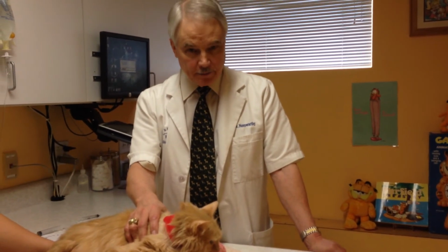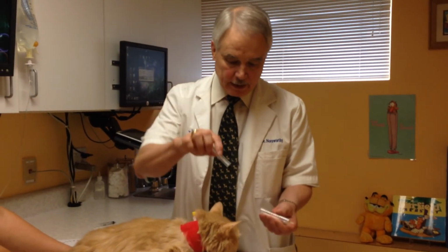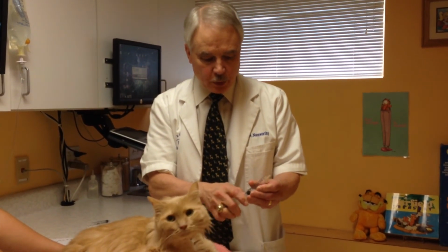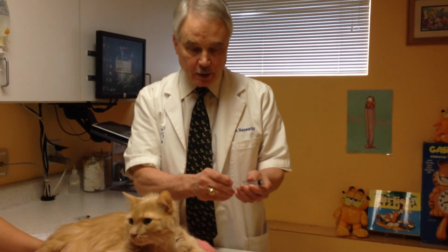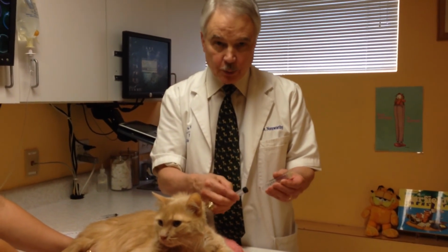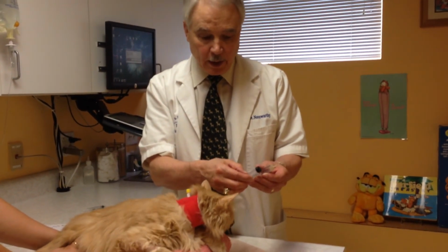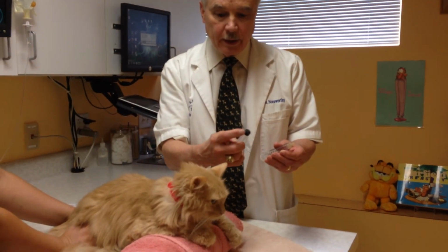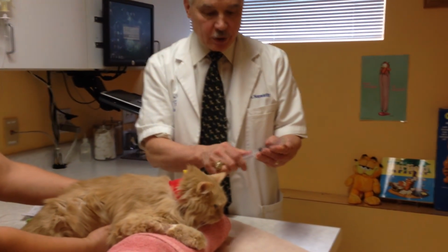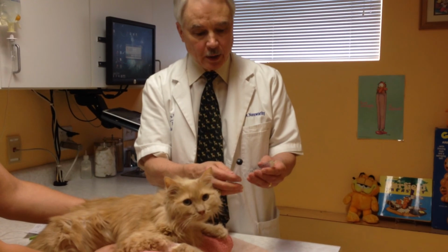Before the next feeding, take the syringe and pull the plunger out. Put it into the food, because the food acts as a lubricant to allow the plunger to run smoothly in the barrel. When you finish feeding, you want to pull the syringe apart and rinse it out. It's better if you don't put the plunger back into the barrel, because the cork will stay wet and it will swell, and it gets to where it doesn't run very smoothly and you have to replace it after just a few uses. By proper cleaning and drying, then these syringes can be used quite a number of times.